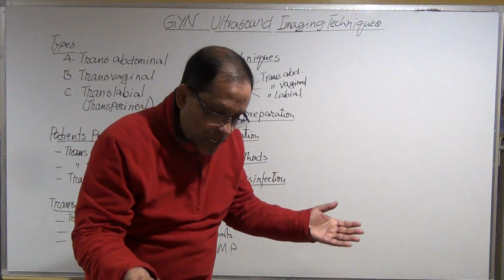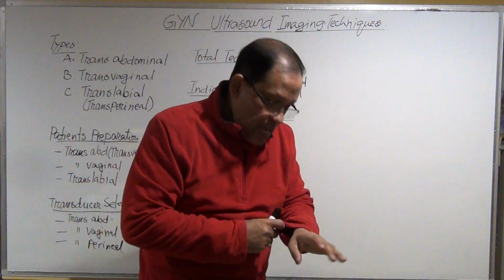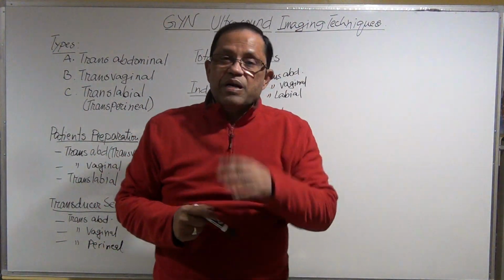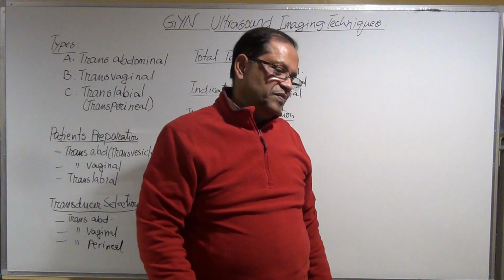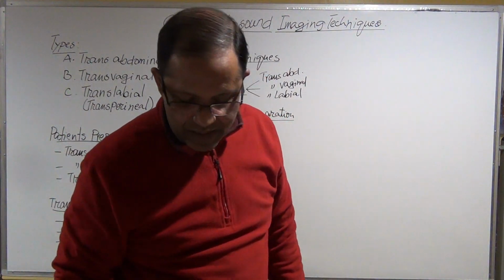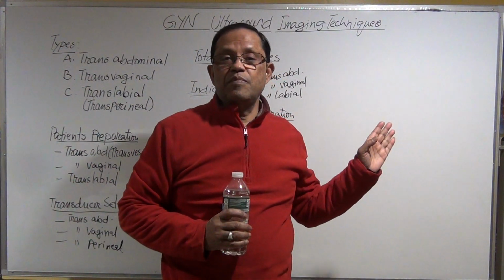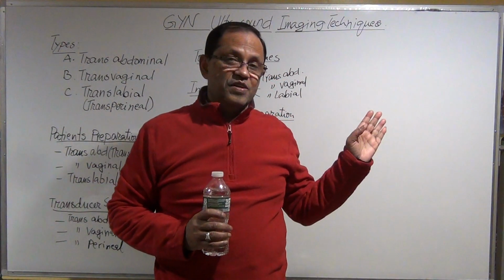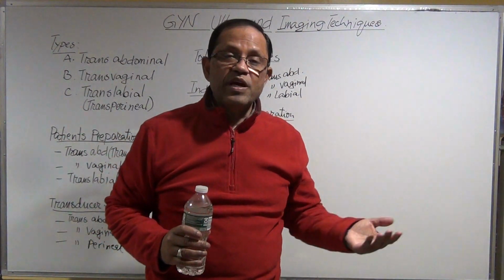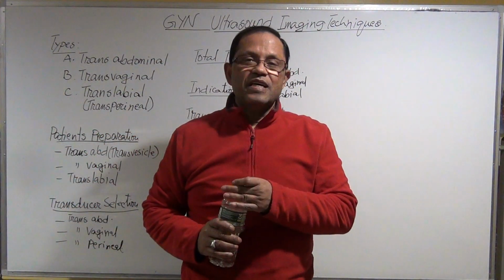And the patient will come to the clinic, and they will say, oh, I have another 15 or 30 minutes to wait, but my bladder is super full. What's going to happen then? When the bladder is super full, they cannot hold the urine. They need to go to the restroom. But it's not like that. I'm very full, I have 2 more patients before me, can I go now? No. You cannot.